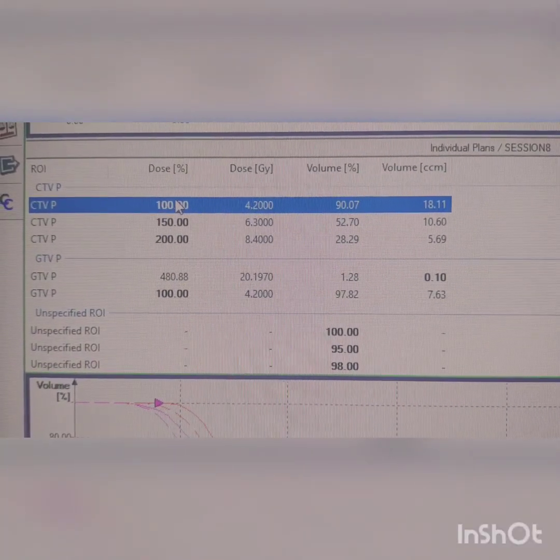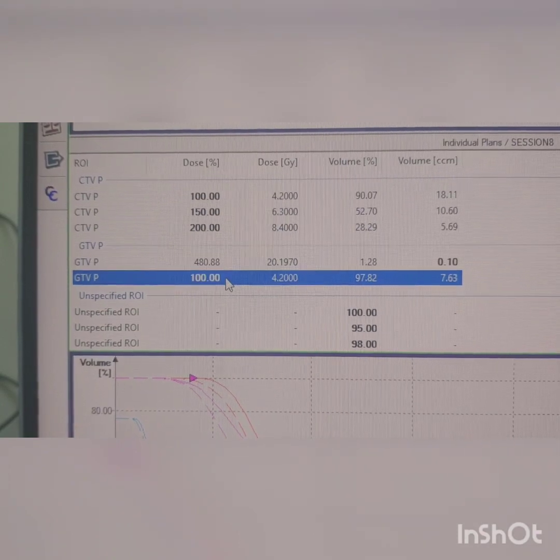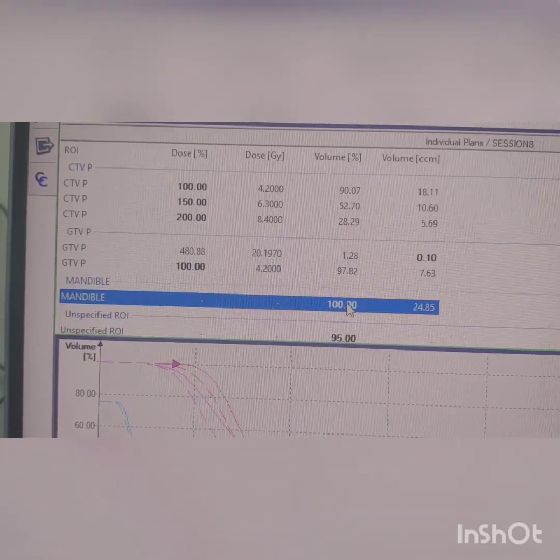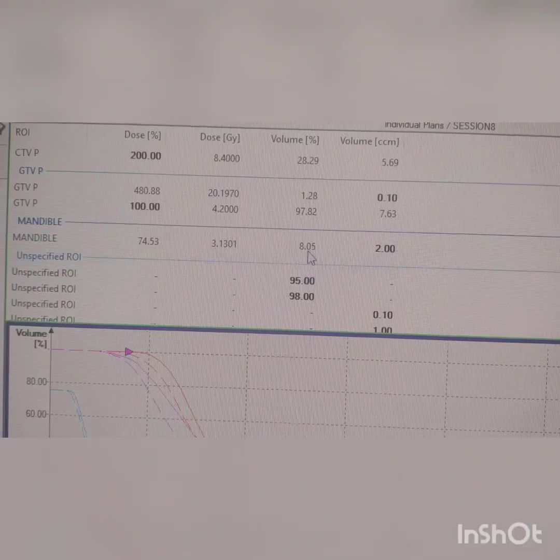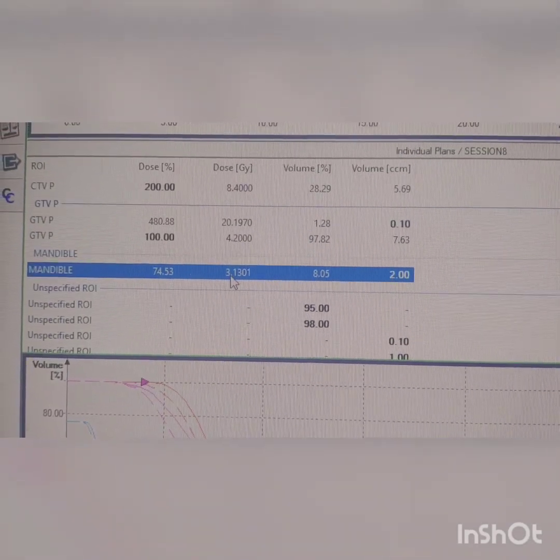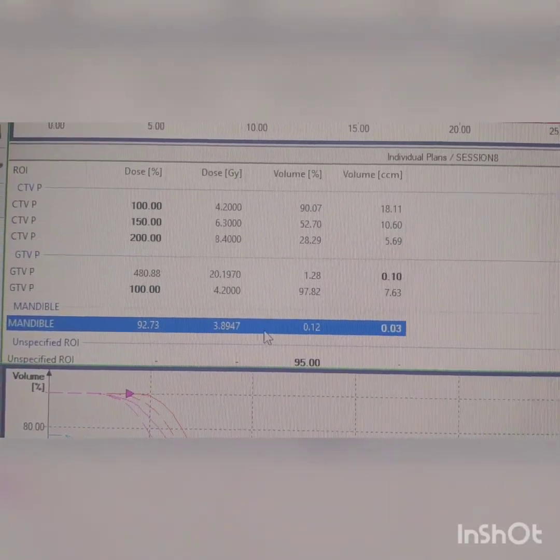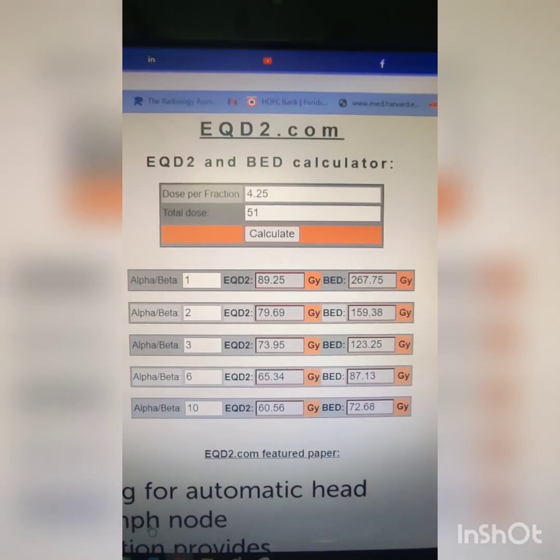Here it is slightly higher and I am accepting that because the GTV coverage is maintained. The GTV coverage shows 100% dose covering 97% of the volume. We also have to check the mandible dose — specifically the max dose to 2 cc of the mandible, which is getting 3.1 Gray. During CT scanning we will put wax blocks, and during treatment we will put lead blocks between the lip and the gingiva.